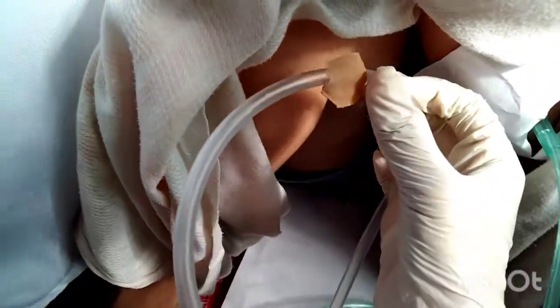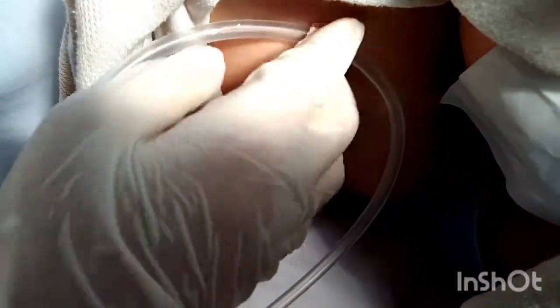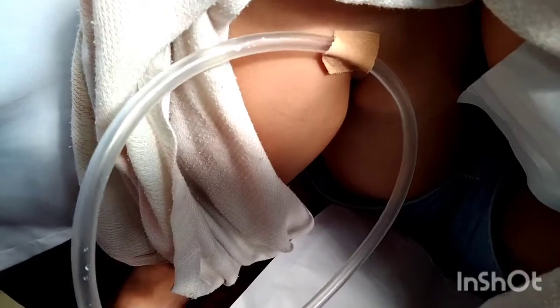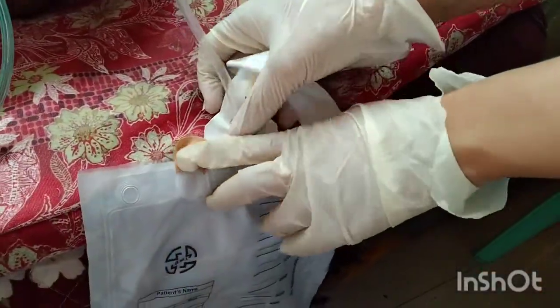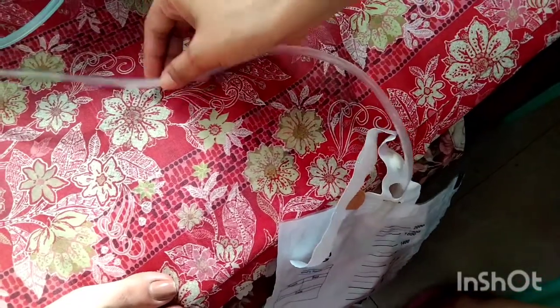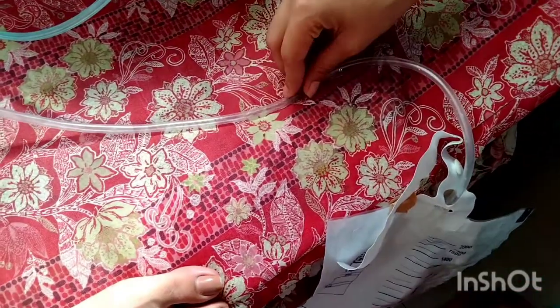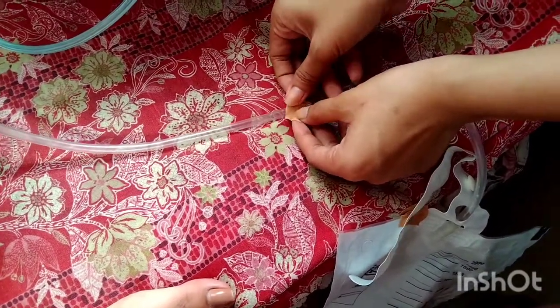Next is to tape catheter. In female client, tape catheter to the inside of the thigh with strip of non-allergic tape and allow for slack so that movement of thighs does not create tension on catheter. Anchoring of catheter minimizes trauma to urethra and meatus during client's movement, and catheter positioned over the thigh prevents kinking. Non-allergic tape prevents skin breakdown.